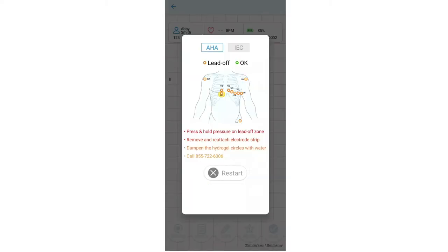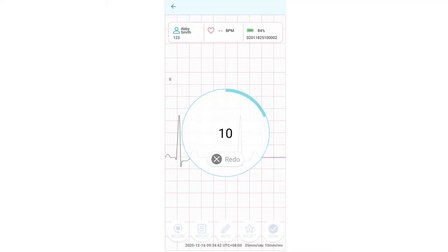This screen displays the status of the leads on the patient's body, which only shows when there's a lead off error. If the lead icon shows lead off, please follow the on-screen troubleshooting tips. When troubleshooting is successful, the app will automatically continue recording a 10-second ECG.